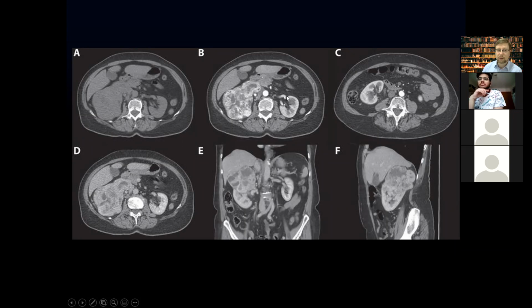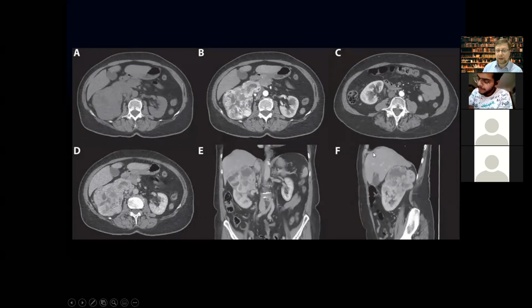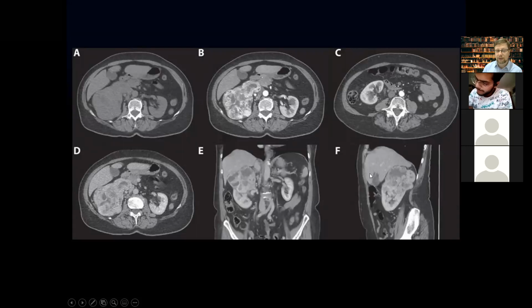This is renal vein. And the second post-contrast image, we call it a nephrographic phase. We can see the renal parenchyma much better here. And third is called excretory phase, when the contrast is excreted into the pelvicalyceal system of the kidney. It's just the main principles of CT imaging. You will read much more.